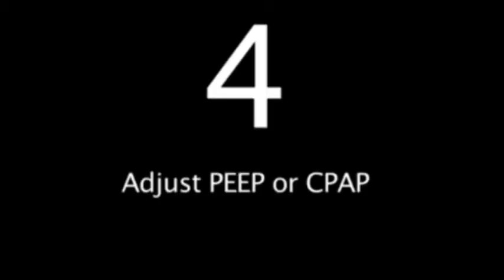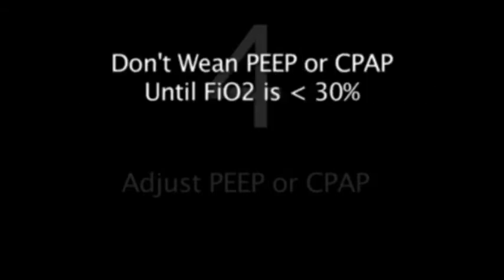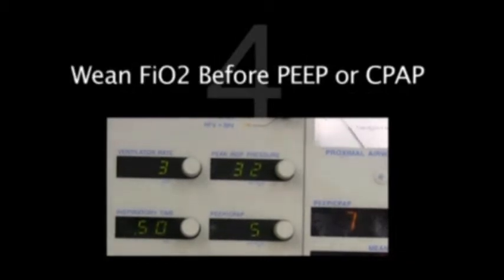Fourth, adjust the PEEP or CPAP. The PEEP or CPAP may be adjusted as necessary to maintain adequate PO2, alveolar inflation, and mean airway pressure, which may decrease as PIP is weaned. Don't worry about lowering PEEP or CPAP until FiO2 is 30% or less. Again, PEEP and CPAP are the safest, most static, stable pressures we apply. Much safer than FiO2.